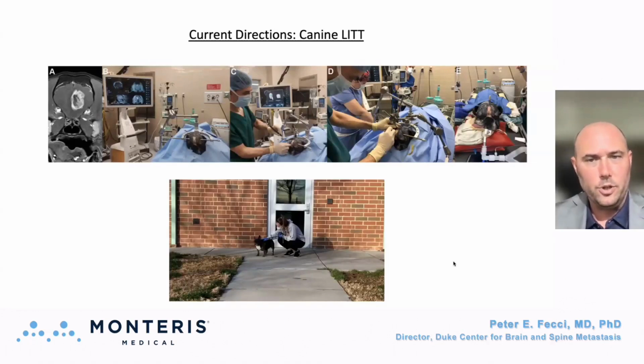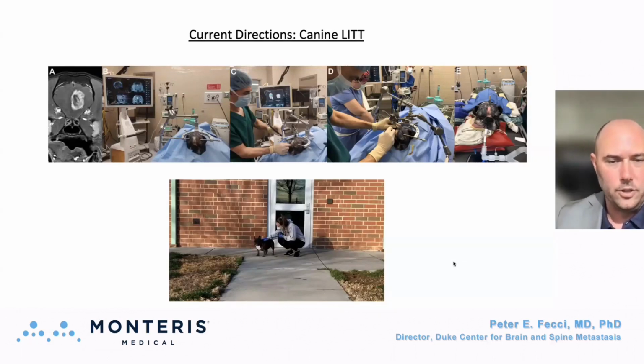We spent a year, the neurosurgeon there and myself, designing the capacity to do both stereotactic biopsies and LITT in dogs. You should know, if you don't, that brachycephalic breeds like boxers and bulldogs get gliomas at an alarmingly high rate spontaneously. 20% of boxers will develop a glioma in their lifetime. It's usually boxers and Frenchies, just based on what America buys, that we're treating. We've now treated 5 or 6 dogs, and we plan to use these dogs as preclinical models to test the Nanostar platform and hopefully develop some improved modifications to the technology.